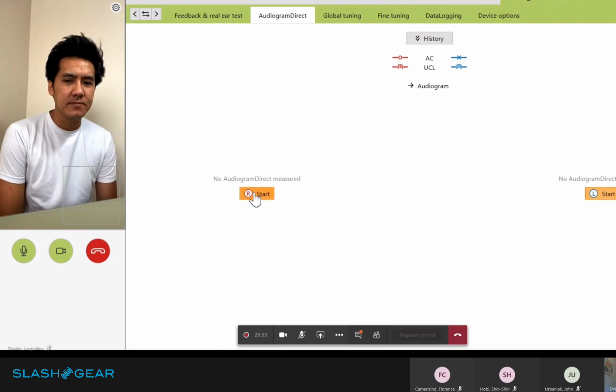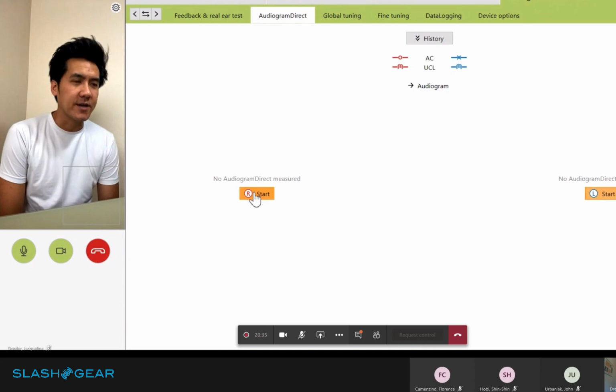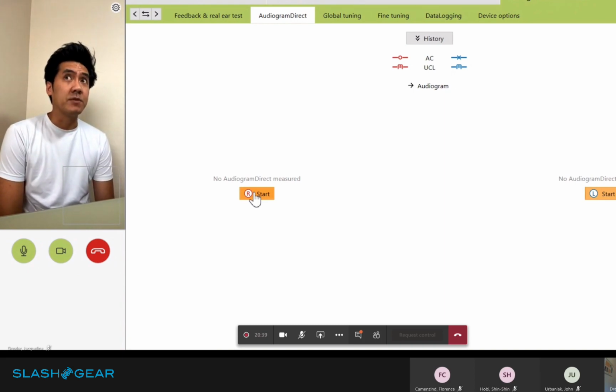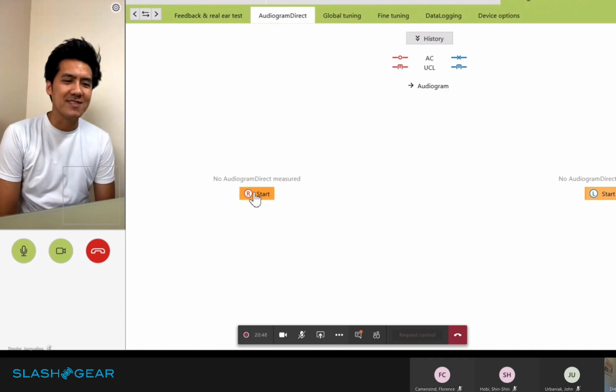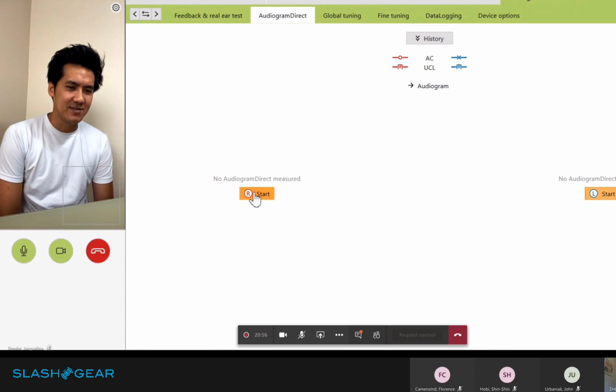What I'd like to do before we get into this is, are you situated in a quiet room? I am. I'm in my quiet office, yes. Okay. All right. Other than the hissing, other than the sound coming from the phone. Okay, that's okay. The reason why I asked is with Audiogram Direct, since we're measuring thresholds, we just want to make sure the room is quiet for you.